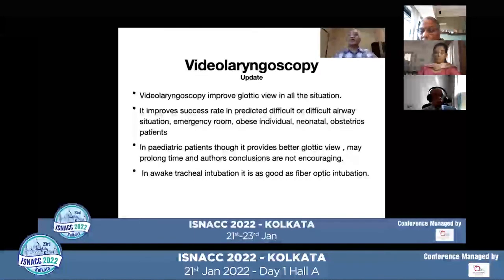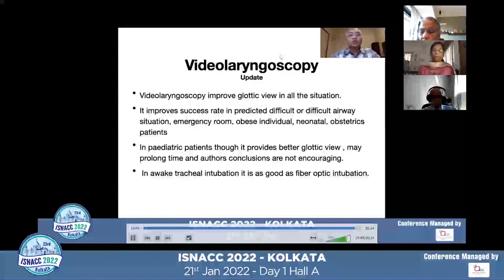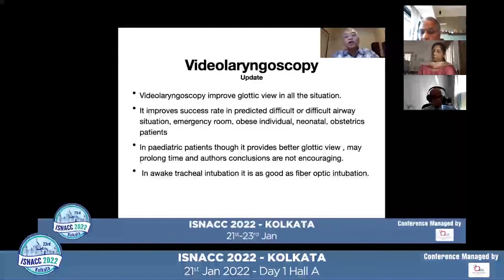So at the end of my lecture, video laryngoscopy definitely improves glottic view in all situations. It improves success rate in predicted difficult or difficult airway situations. It has been found helpful in the emergency room, in obese individuals, obstetric patients, and neonatal patients. In pediatric patients, though it provides a better glottic view, it may take prolonged time and the authors' conclusions are not encouraging. And in awake tracheal intubation, it is as good as fiber optic intubation.